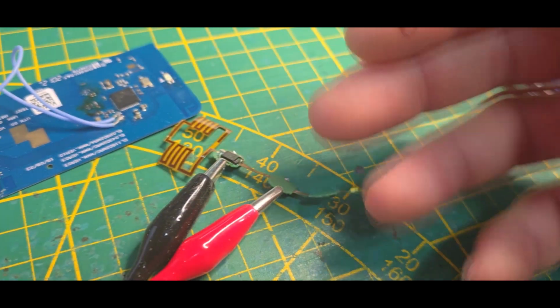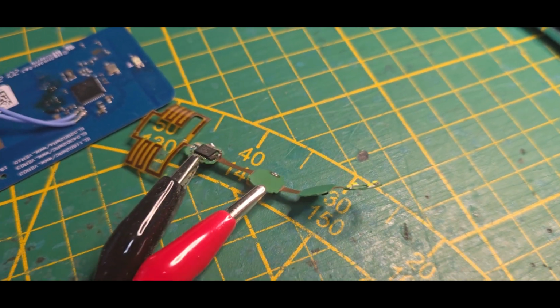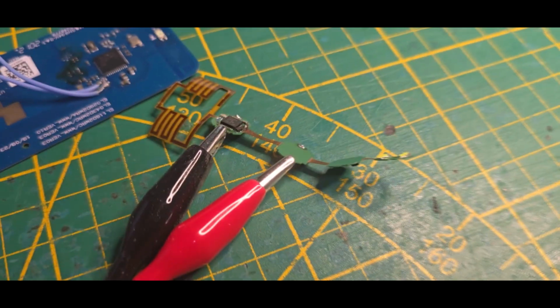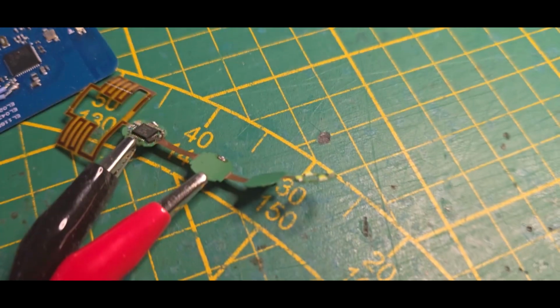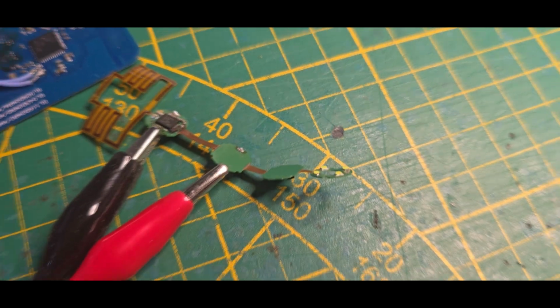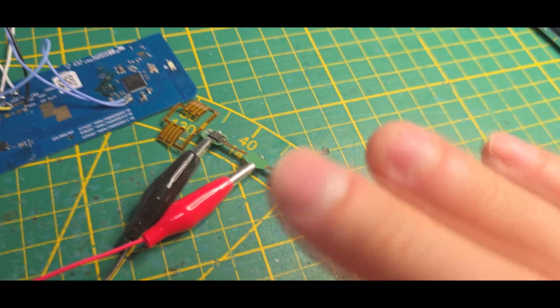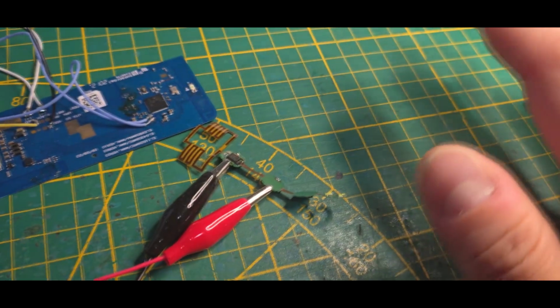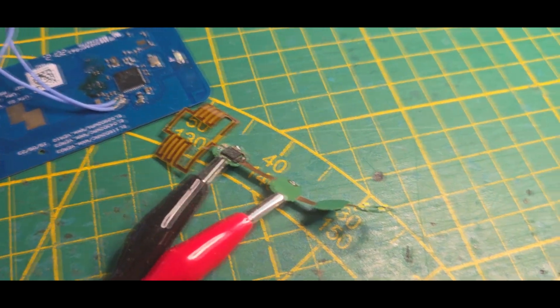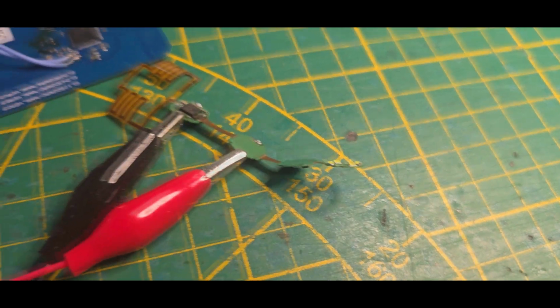I did take a look inside the firmware for other stuff, and it's just setting the power output for the RF transmission, setting the channel of the RF transmission and such. So not even a firmware update is included. They do have some, I think, FCC test modes where the camera will be transmitting endlessly or receiving for endless time. And yeah, let's see if we can get some images out of it.